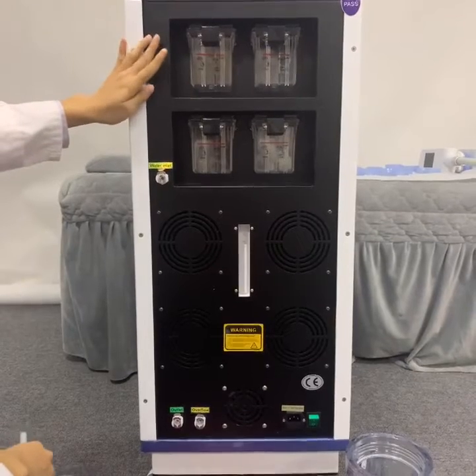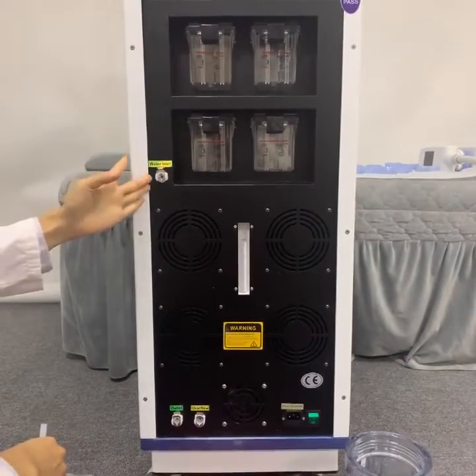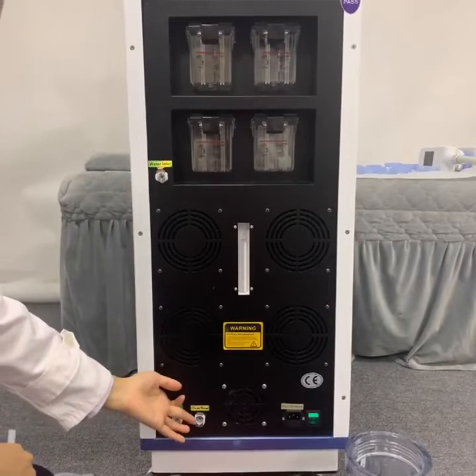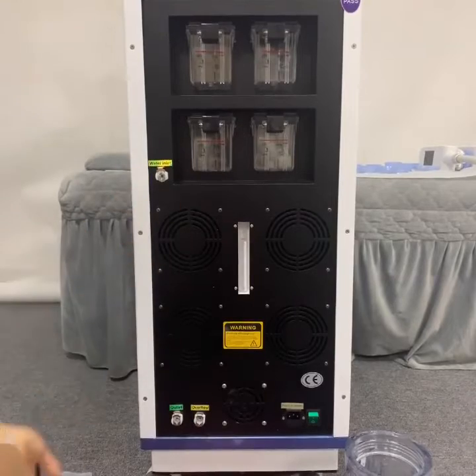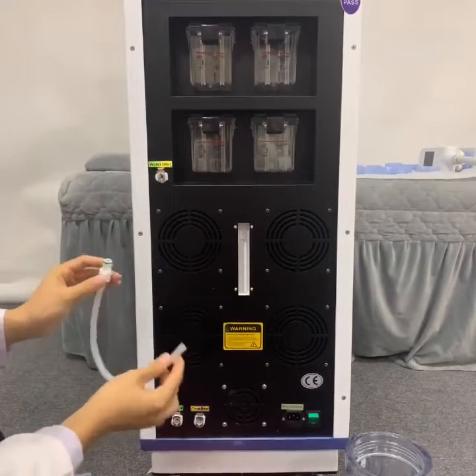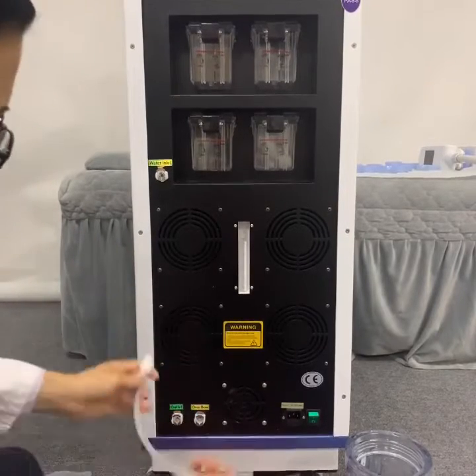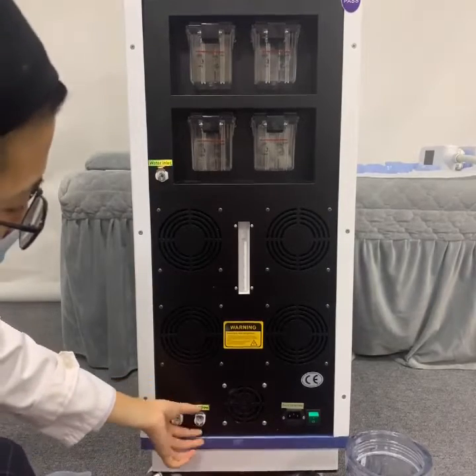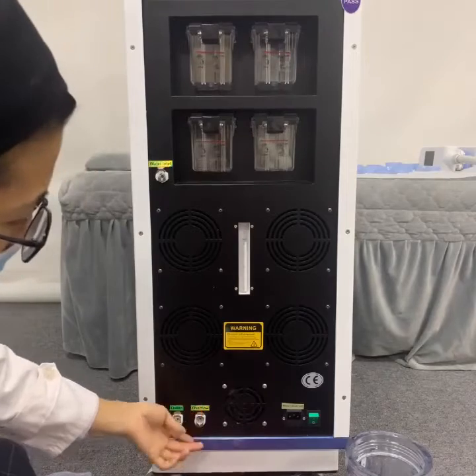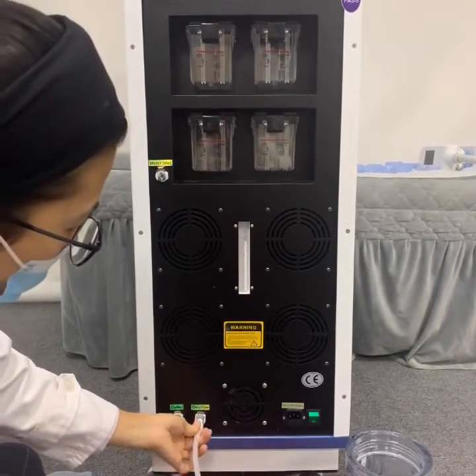Before using this machine, we have to inject full water inside. This is the water inlet hole, water outlet hole, and the water overflow hole. Now we will inject the water. Firstly, we have to insert two tubes. One is the tube for the overflow hole. Before installation, we have to press this silver button and make sure this tube is up. Then we will insert the tube.